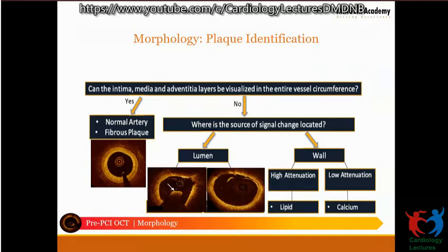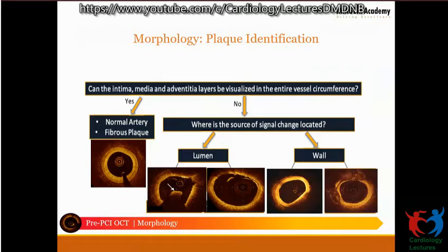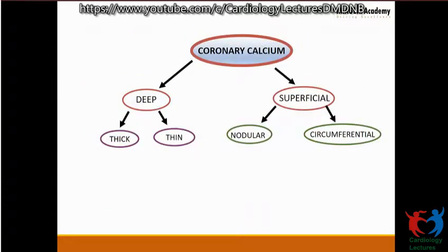If the problem is in the vessel wall with high attenuation, that means the light is being completely absorbed, you're dealing with a lipid plaque. And if there is low attenuation in the vessel wall, you're dealing with a calcific plaque. So the basic algorithm tells you to identify the abnormality in the vessel wall. It could be either a lipid or a calcific plaque. And if it's in the lumen, then it's either a red or a white thrombus.